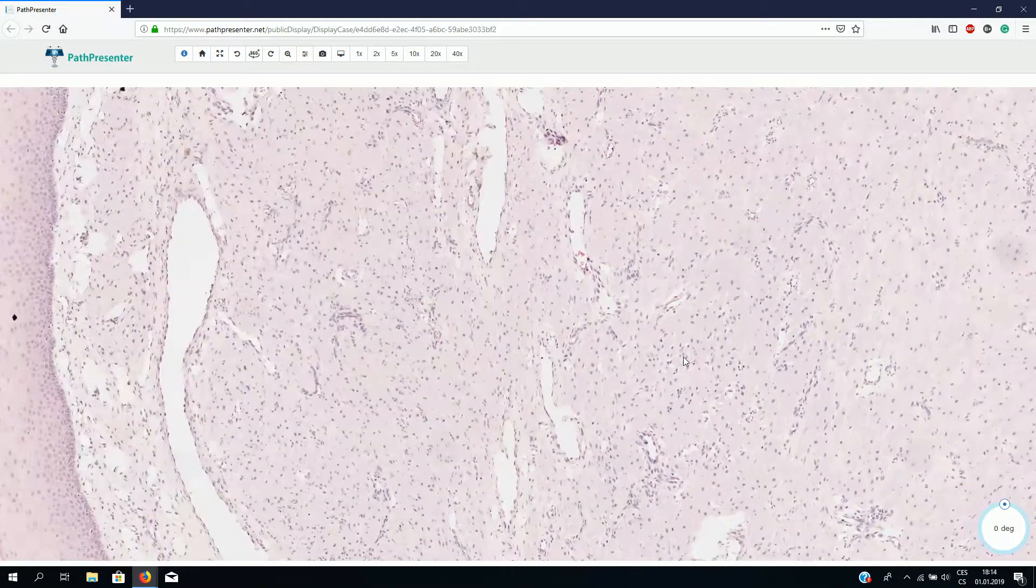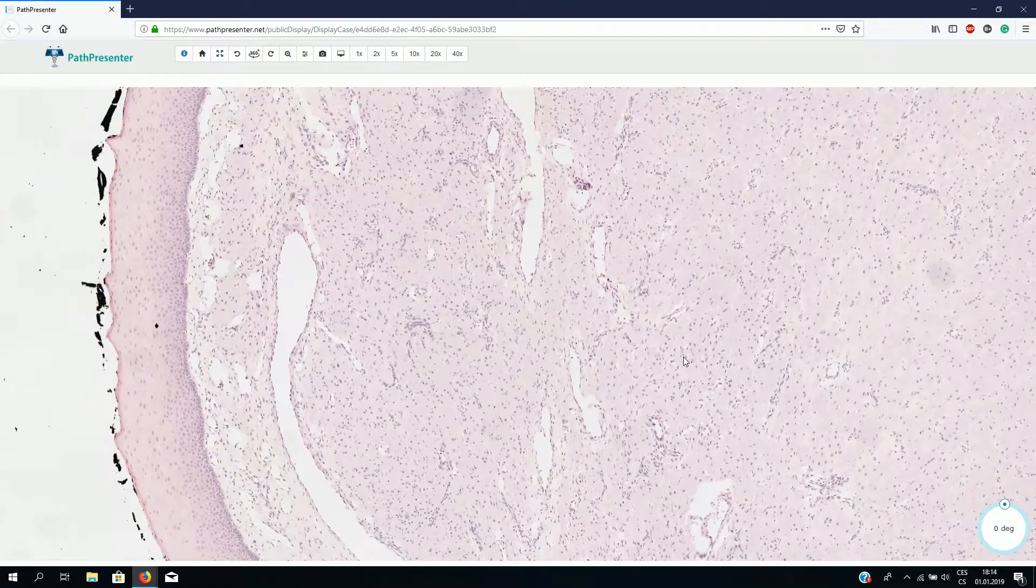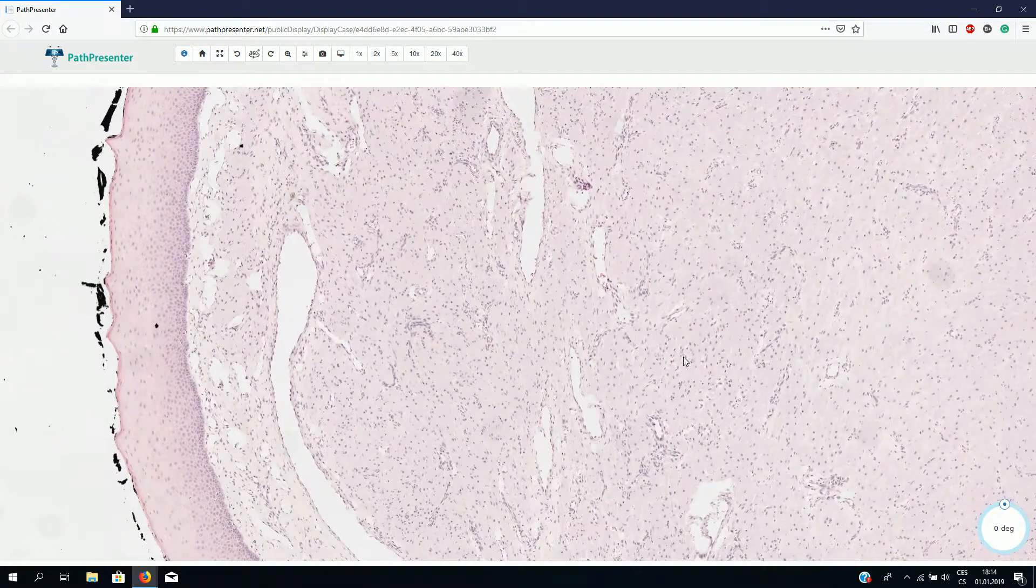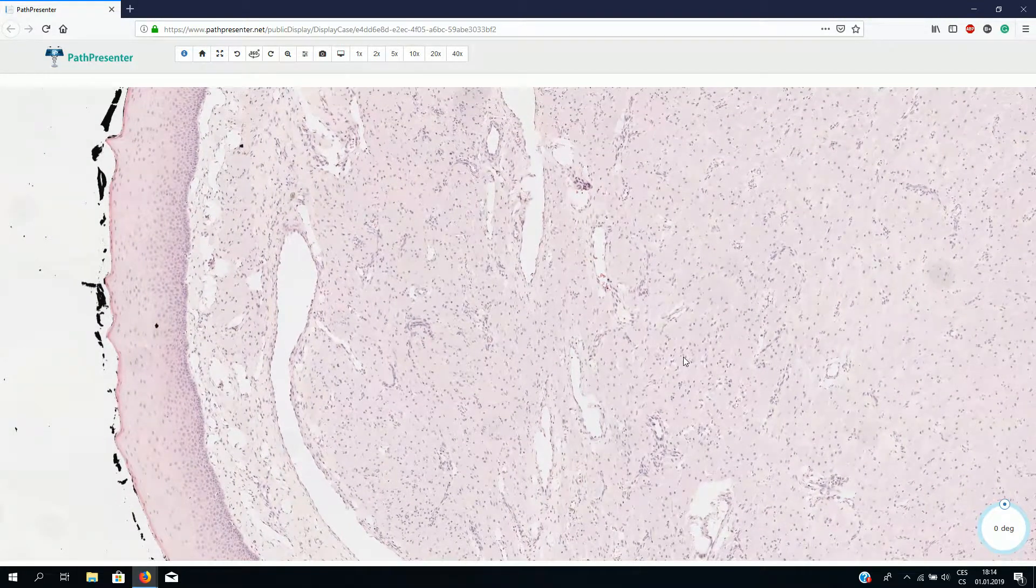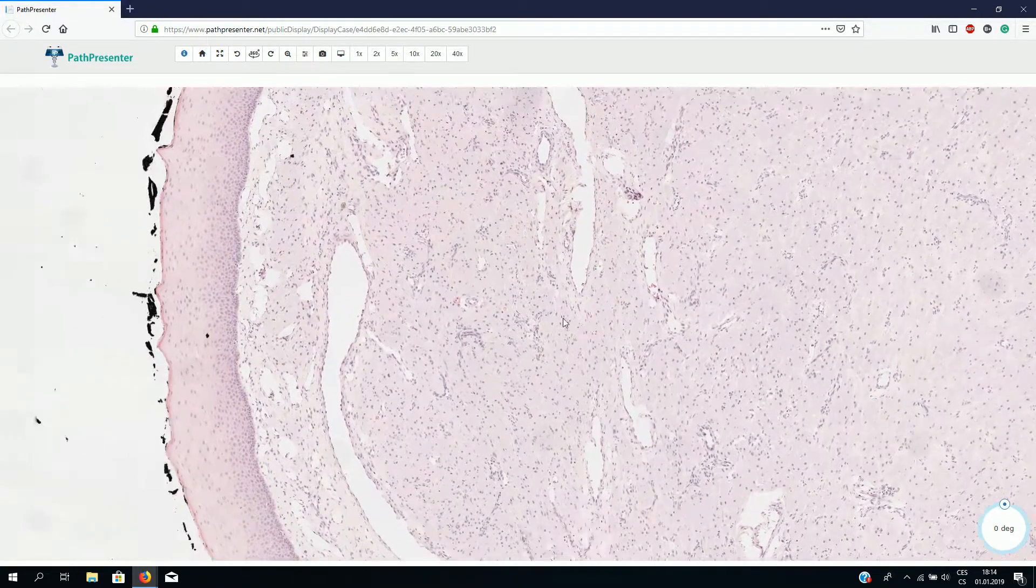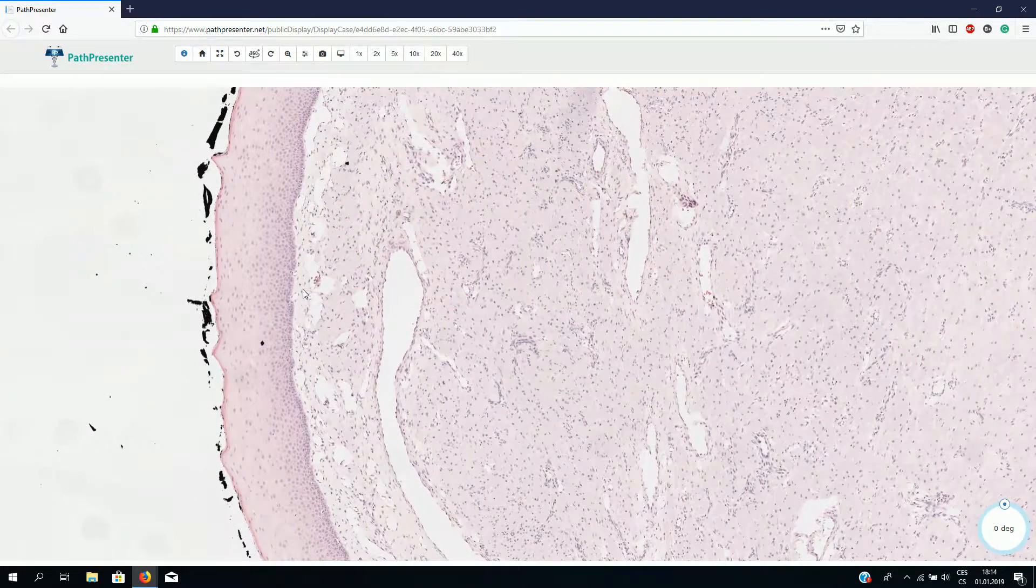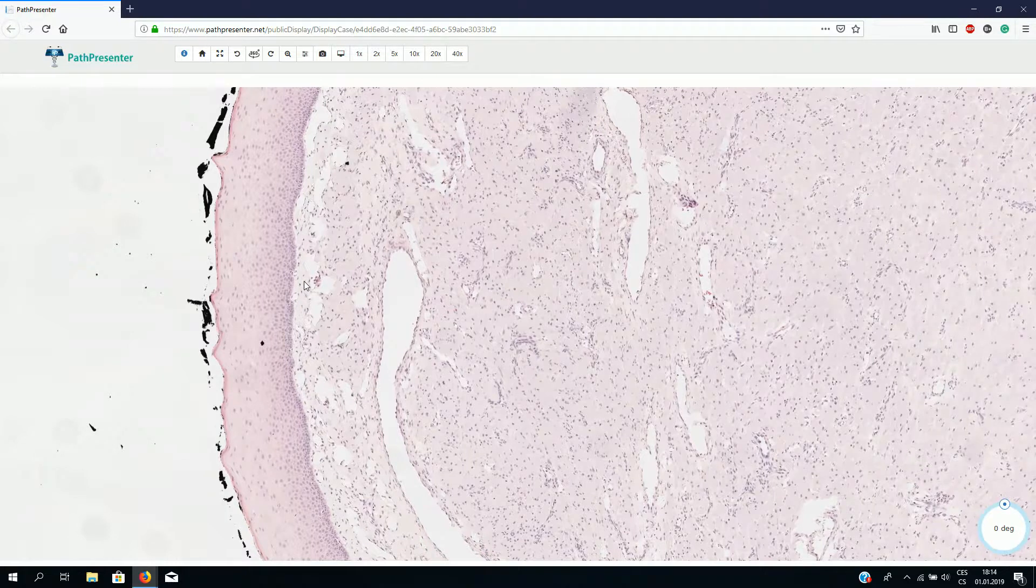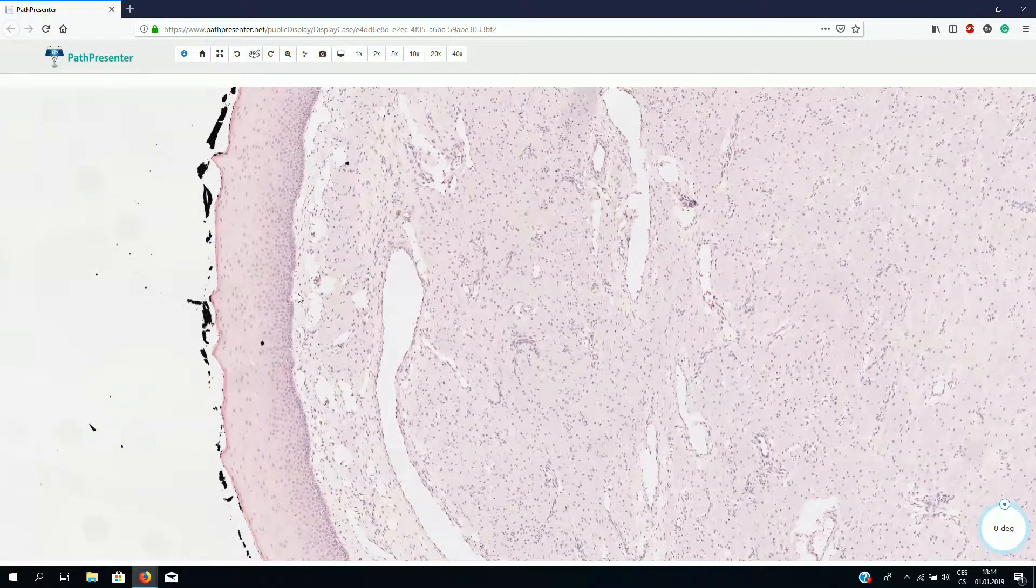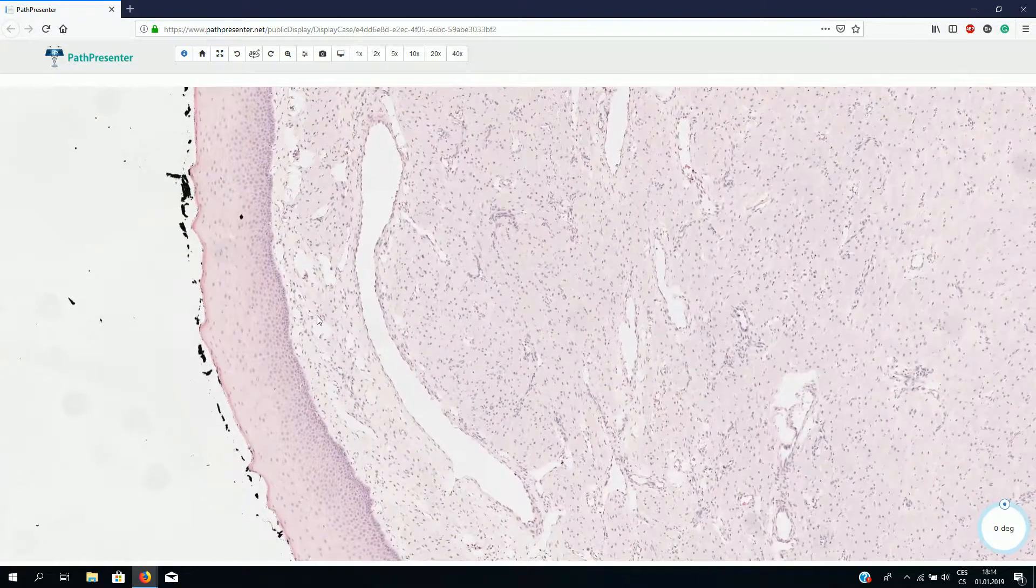The main differential diagnosis is granular cell tumor, which should be S100 positive and SOX10 positive. It is also typically associated with pseudoepitheliomatous hyperplasia of the non-keratinized stratified squamous epithelium.